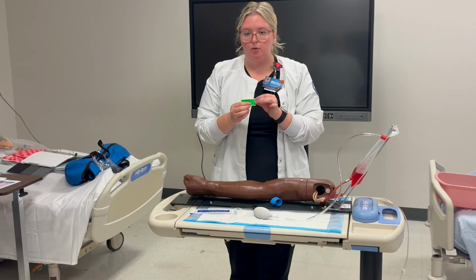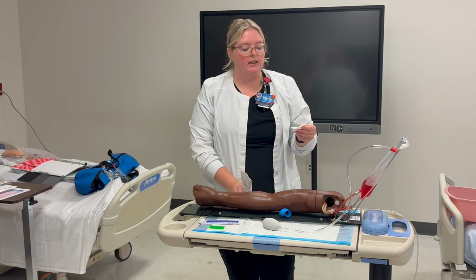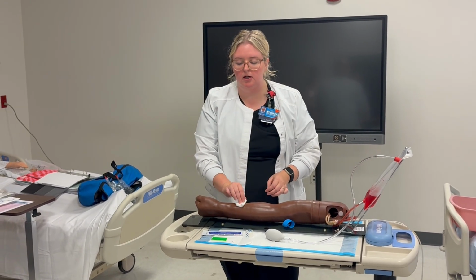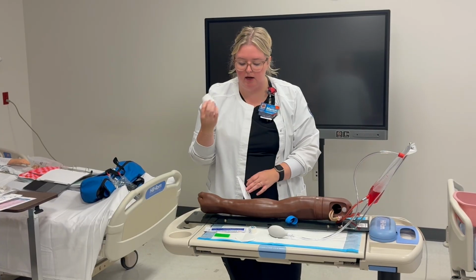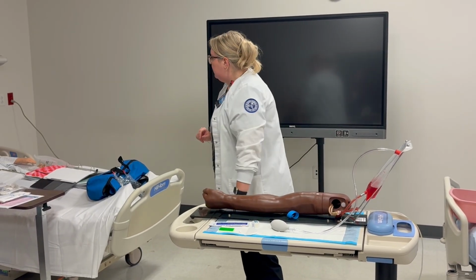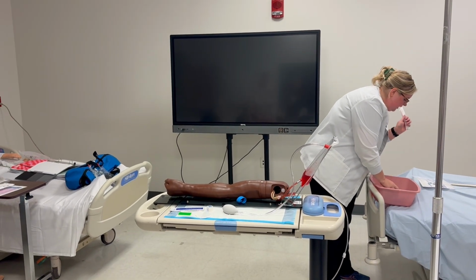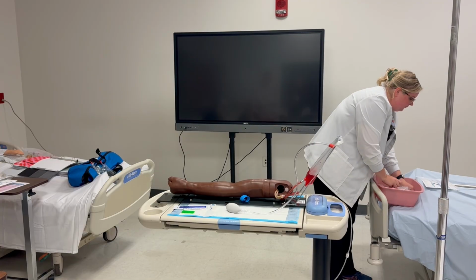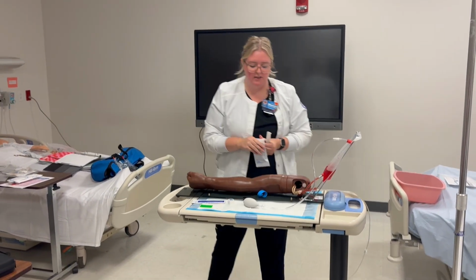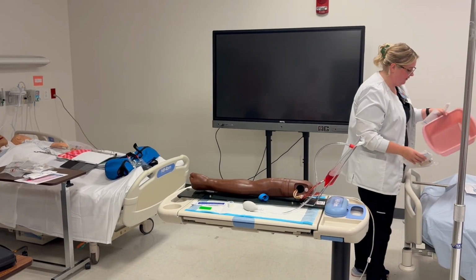Here is your label. And they always put gauze in here in case you were to miss the IV. You can take it right back out and then you would put this here, but this is only if you miss the IV and you have to do another one like in real life. Okay? I need my IV and I need a saline. Mrs. S, I need a saline flush too. Forgot to put that in my bucket, and I got 3 IVs.